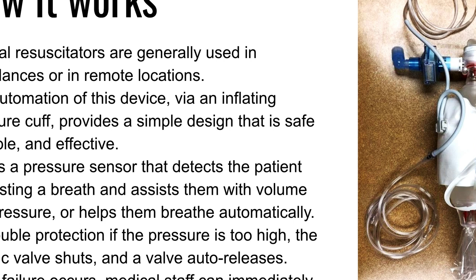The Ambu bag is often a go-between before someone is put on an actual ventilator. We automated this device using a blood pressure cuff — a piece of equipment found in any hospital — which is safe, portable, and effective. When inflated, it squishes the Ambu bag providing a breath, and when vacuumed from the hospital vacuum system, it expands and takes the air out. A pressure sensor detects the patient requesting a breath and assists them with volume and pressure, or it can work automatically to help the patient breathe if they lack the capacity to initiate a breath on their own.